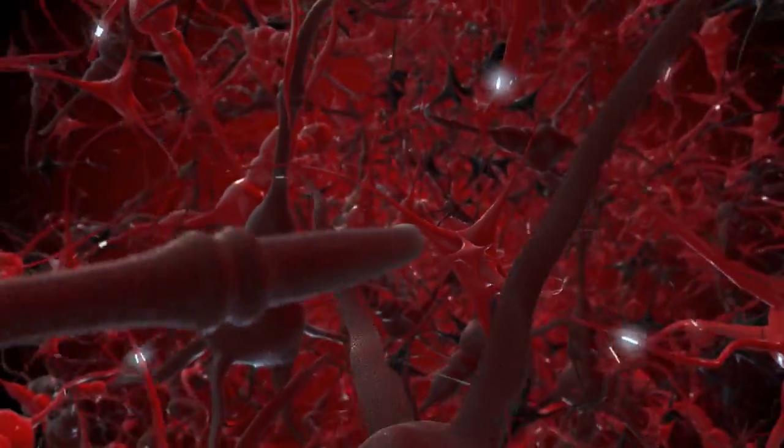What's going to happen if one person's holding the rope, the other person's holding the rope, and they flick the wrist, is they're going to get a wave that travels all the way down from me to Aruna over here, out of the frame. That is an action potential. So if I stimulate the nerve, it's going to send an electrical signal that is exactly like that, a wave form, and how tall or high that wave is reflects the health of the nerve cells that make up that nerve, or the health of the axons.